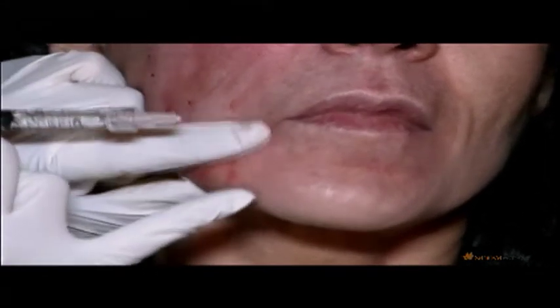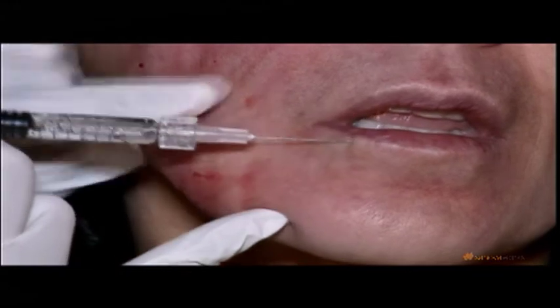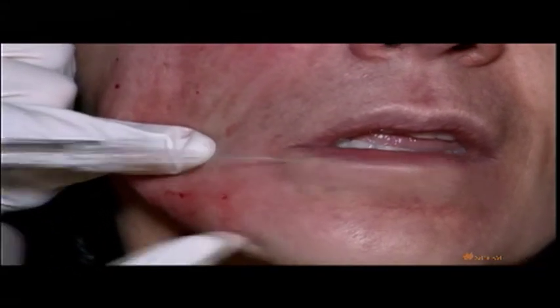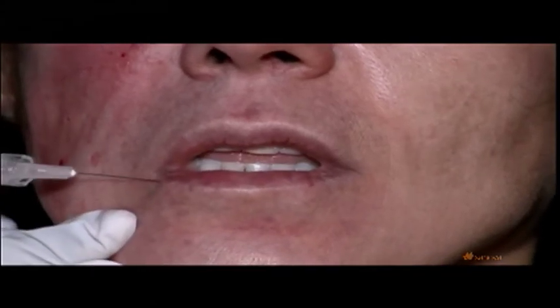And what we can do when we're using an HA that is suitable for superficial injection is we can thread it along the vermilion border, just as we used to do with collagen. And in doing so, we can restore the white roll. Again, if we turn Katya's face, just do a little bit more here, and then I'll show you.